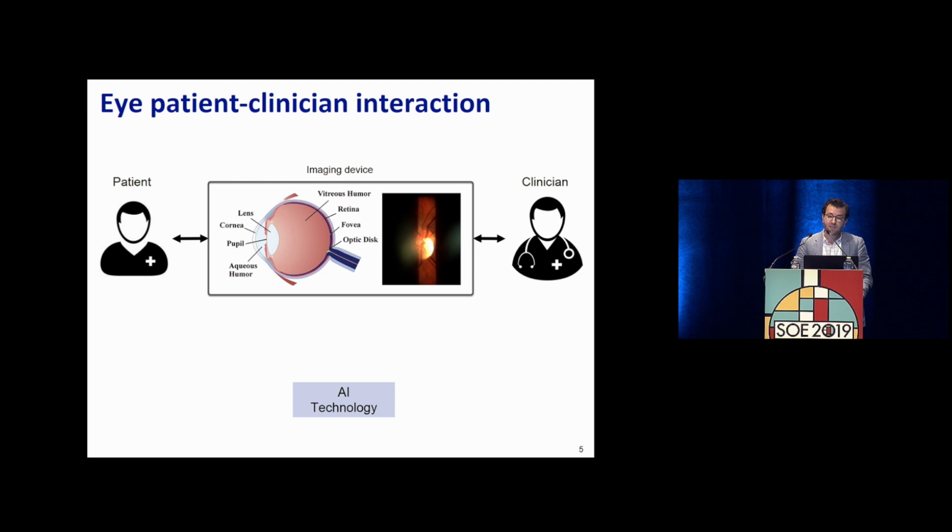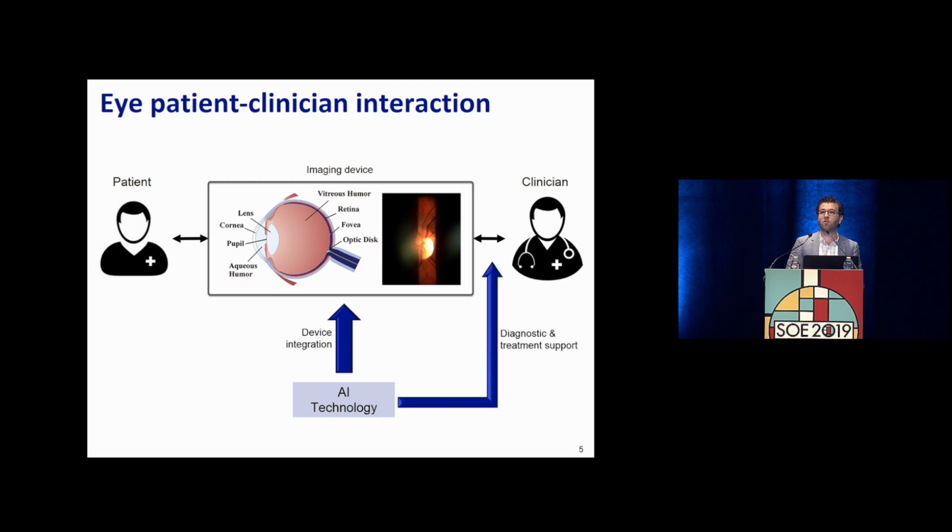And what that implies is if you have AI technology, this technology can somehow integrate the device itself, or potentially provide some clinical support for a physician directly, and as we're starting to see, actually empower patients directly through phones and apps and websites, right? So once you have an AI technology, there's hope for it to integrate forward.